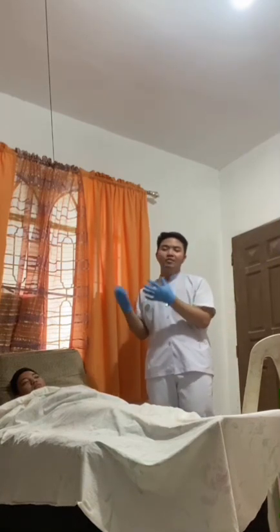And next, I'm going to identify the patient, explain the procedure to the patient, and provide privacy.